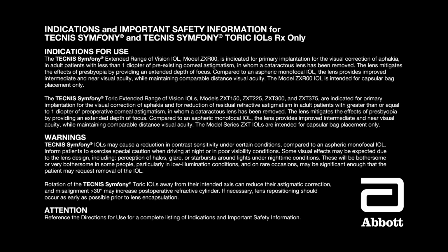The Tecnis Symfony Toric IOLs, model ZXT150, ZXT225, ZXT300 and ZXT375 are indicated for primary implantation for the visual correction of aphakia and for reduction of residual refractive astigmatism in adult patients with greater than or equal to 1 diopter of preoperative corneal astigmatism in whom a cataractous lens has been removed.